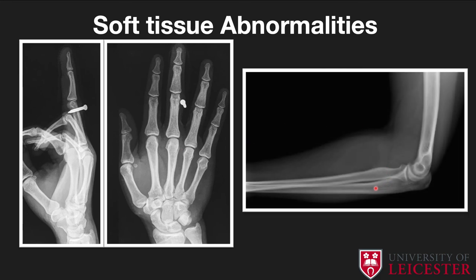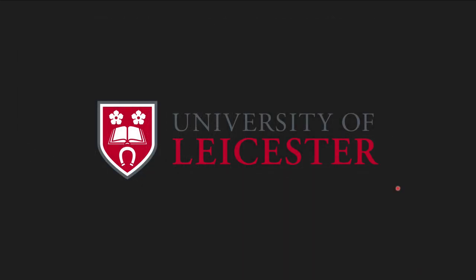Here on a lateral elbow radiograph with no fracture demonstrated, there is a subtle rounded well-defined lucency in the soft tissues of the forearm with associated soft tissue swelling, no anterior humeral line fat pad sign. This soft tissue lucency is in keeping with a lipoma. If there is trauma, think of collections and hematomas. Further imaging may be needed if there's no underlying fracture identified.